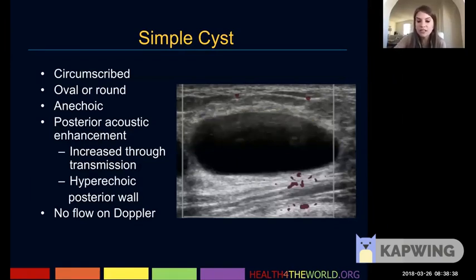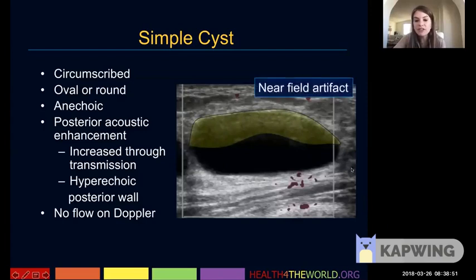Occasionally, let's go back, you might see in the near field some hypoechoic area. It's often very well defined and linear, and this is just artifactual.